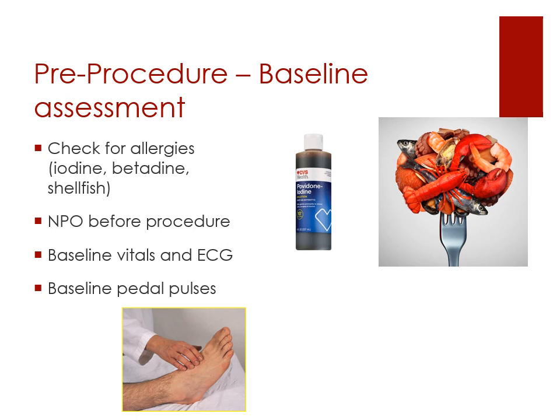Of course, we're doing baseline vitals, and we're doing a baseline EKG or ECG, that tracing of the heart. And then remember, we're going in the femoral artery, which means we're going to be occluding the vasculature down into the leg. So before they do the procedure, they're going to make sure this person has pedal pulses. And in fact, not only do they find the pedal pulses, they actually will mark where the pedal pulses are.